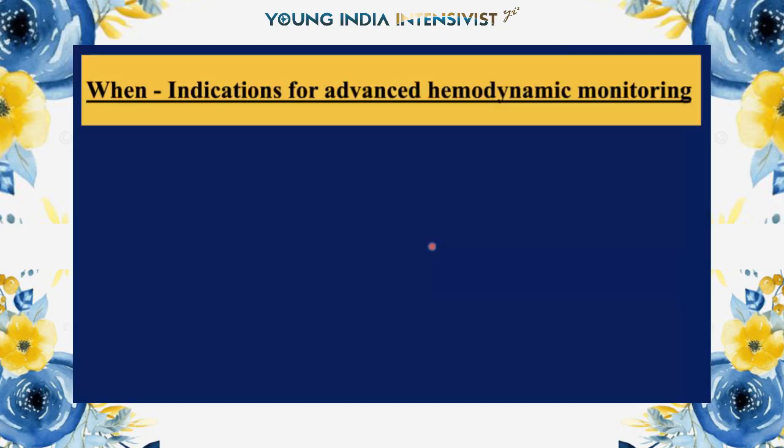Okay. Now we have understood the why part. Why do you need complex cardiac output monitoring? Because you can't keep on pumping fluids into your patient in the ICU. Only 50% of patients will be fluid responsive, and you don't know which of the 50% your patient falls in. And second, overzealous fluid resuscitation is going to be harmful.